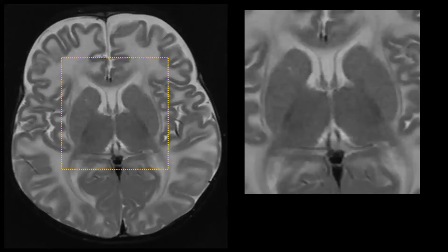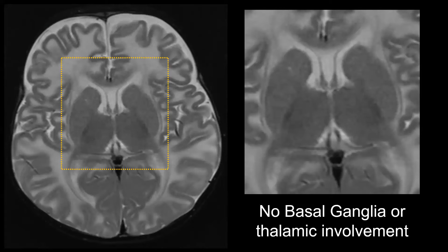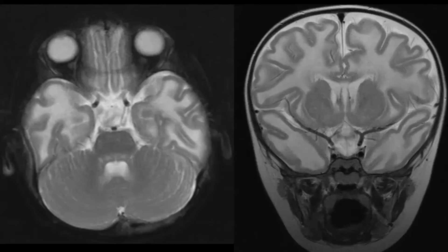Looking at the basal ganglia in van der Knaap disease: there is no basal ganglia involvement whatsoever — normal signal in the basal ganglia and the thalamus. Infratentorially, the brainstem and cerebellum look essentially normal in this patient, with perhaps slightly increased signal due to lack of myelination.